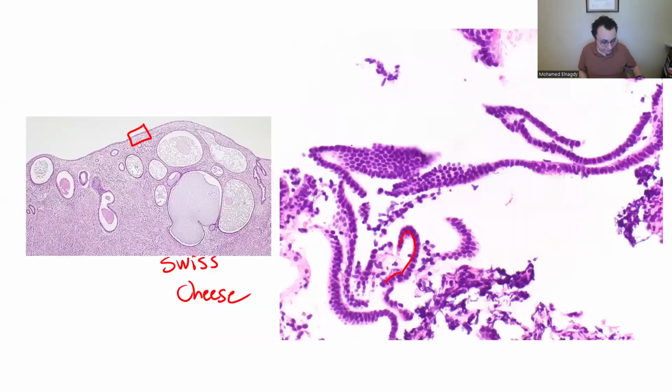Question, can you go back to that slide? The cystic gland stuff kind of looks like a Nabothian cyst, but I know it's a different location, of course. But in a Nabothian cyst, if you go to high power, you'll see this secretory lining. The lining would be like endocervical lining. But here, if you go high power, you'll see these atrophic cells, and there's no secretions there. There are no endocervical columnar cells with apical mucin, you know. So that's how we differentiate it from the Nabothian cyst.